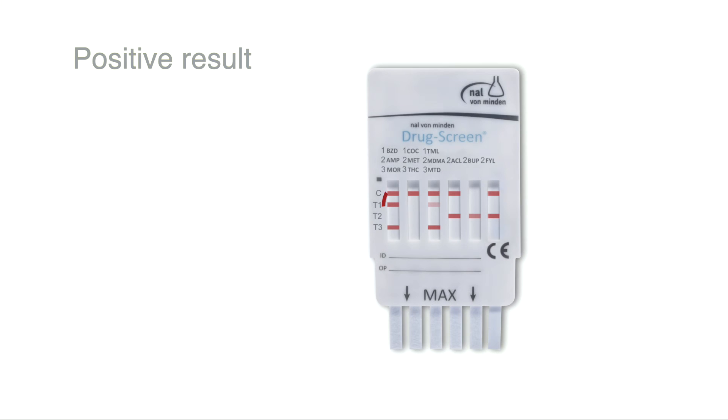A positive result is indicated by the absence of a line in the test region. A control line signifies that the test has performed correctly and should always be present. Compare your results with the charts given in the instructions.